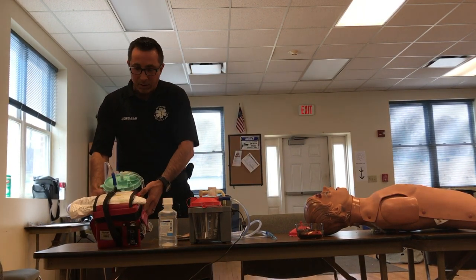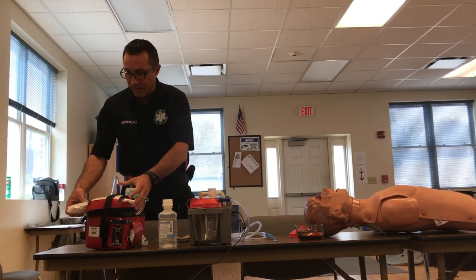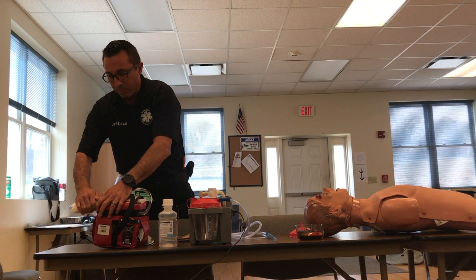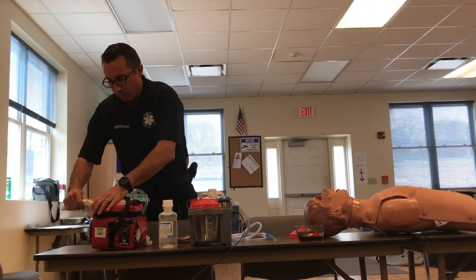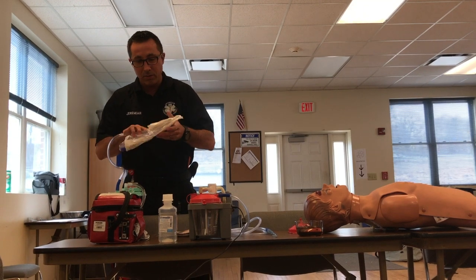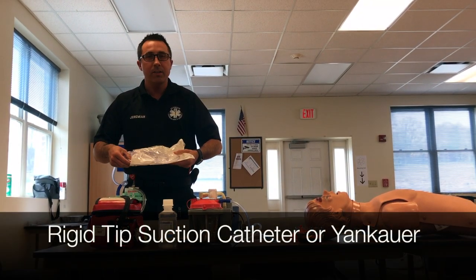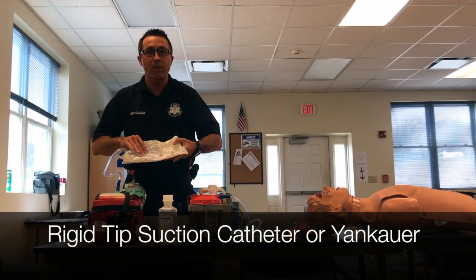This is one of the units off of our ambulance here. It's a newer model, and I want you to see that it comes kind of set up and ready to go in the event that you have to suction a patient's airway. You have your suction catheter here — this is a rigid tip suction catheter, also called a Yankauer.